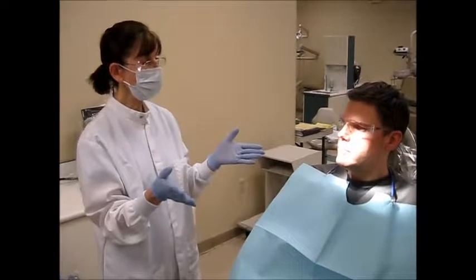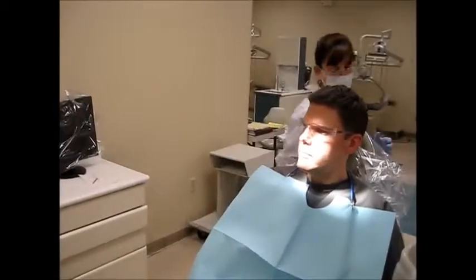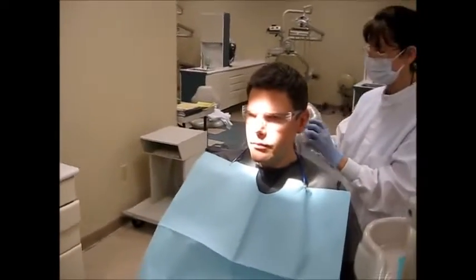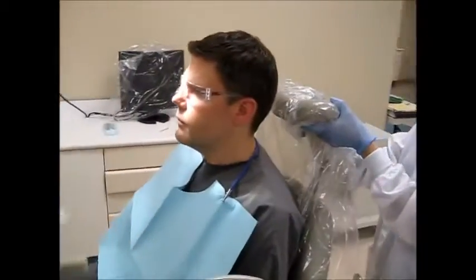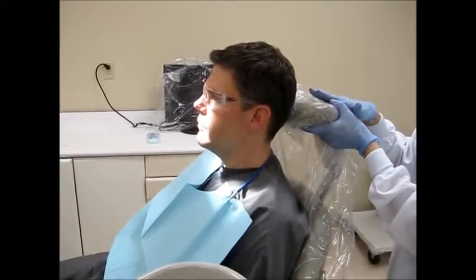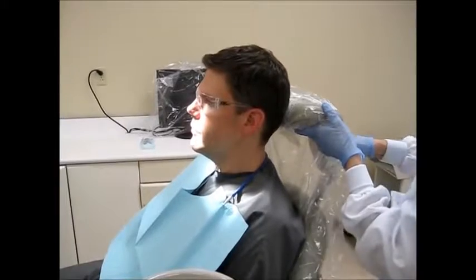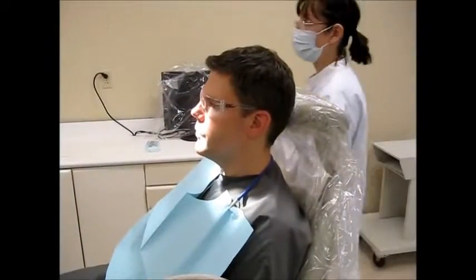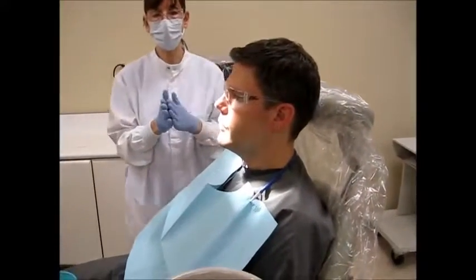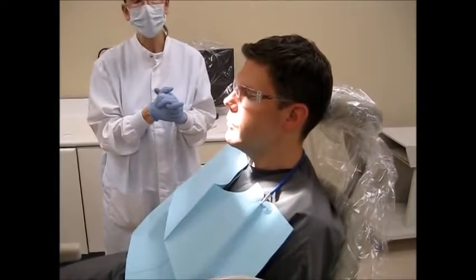You would have your patient seated in the most upright position. You would ensure that the headrest had been placed as far forward as it could be. You would ask the patient to bring their head back, and oftentimes placing the headrest this way is most effective, tightening it, because we want to ensure that the patient cannot recline back to allow the fluoride to go down the throat. We want it to go out through the saliva ejector.